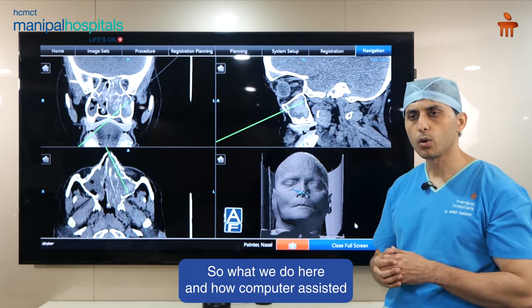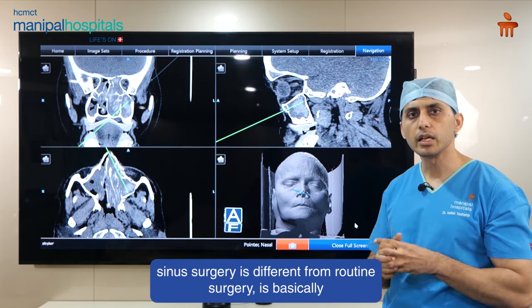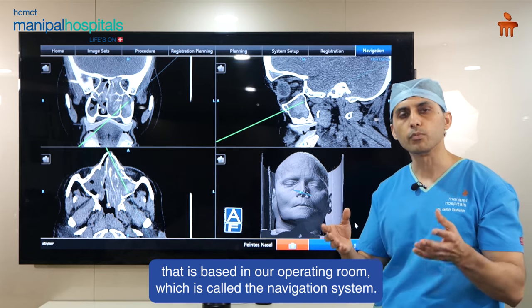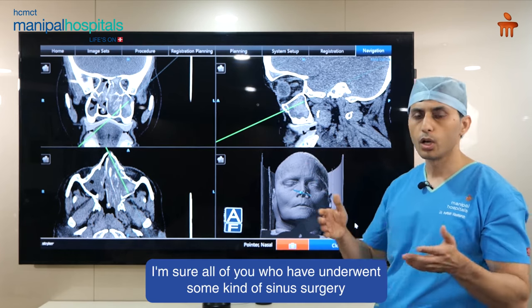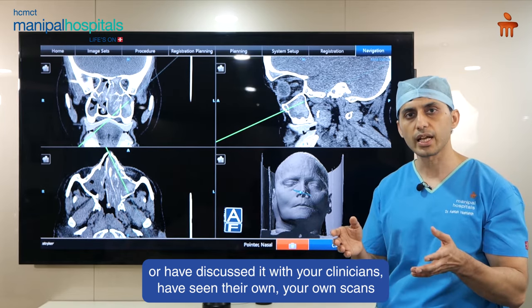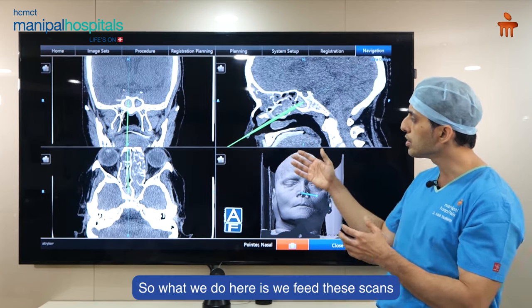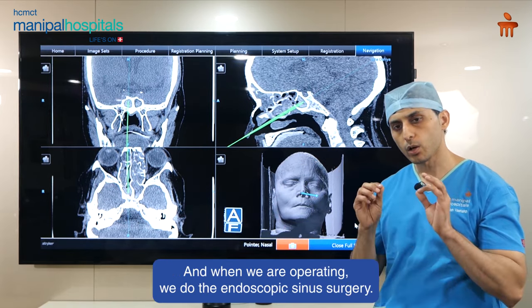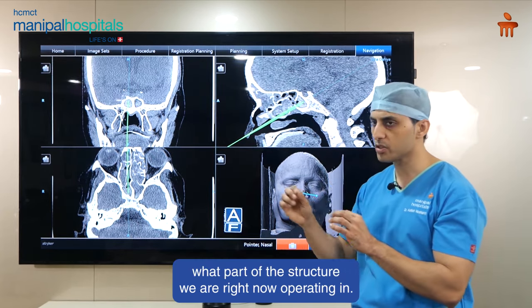What we do here, and how computer-assisted sinus surgery is different from routine surgery, is that we feed the patient's pre-operative CT scans into a system in our operating room called the navigation system. When we are operating and doing the endoscopic sinus surgery, we can precisely correlate what part of the structure we are right now operating in.